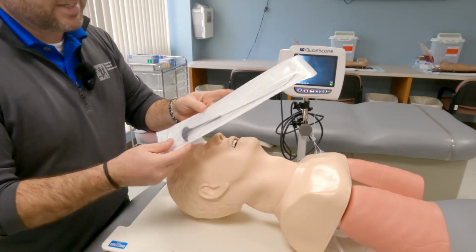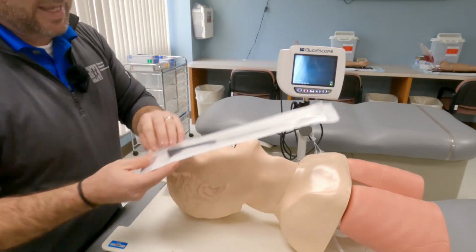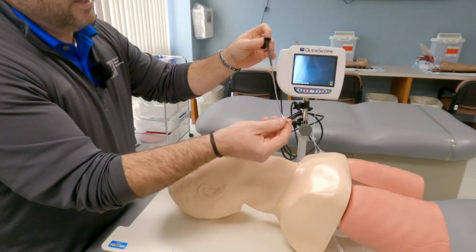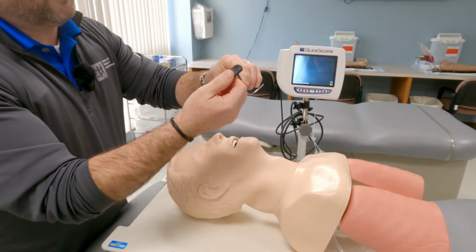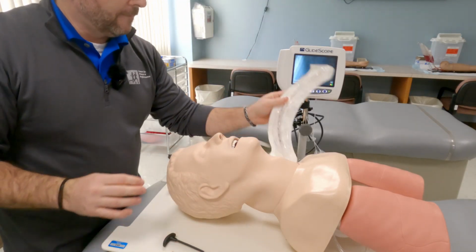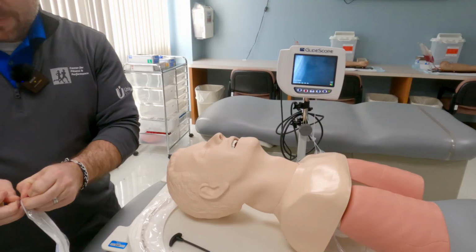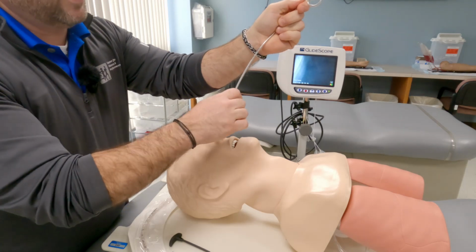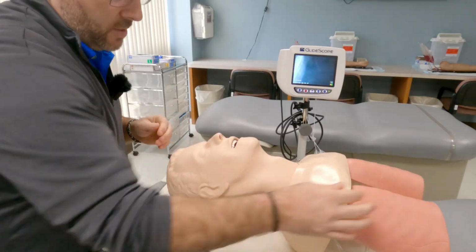Another piece that's going to be different than with direct laryngoscopy is you're going to use a rigid stylet. And this rigid stylet, I want to compare this. You can see it doesn't bend at all. It actually has this piece on the back right here, and it almost acts like a joystick. I'll show you a little bit about how that works once we put the endotracheal tube in. A standard stylet, just for review, is semi-rigid. It looks something like this, but can be bent to whatever angle we would like. We usually use that with direct laryngoscopy. Not in this case, so we're not going to use that one.